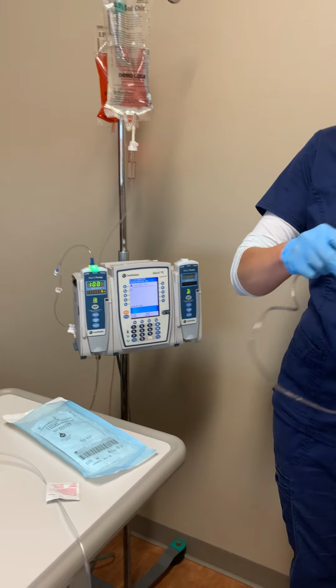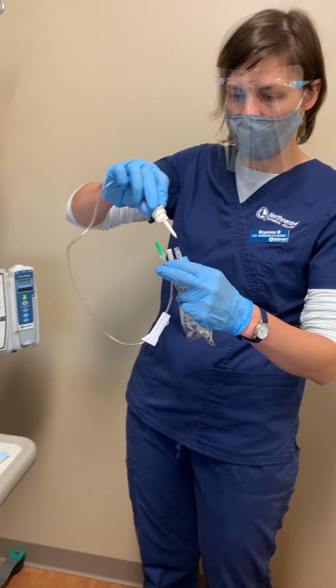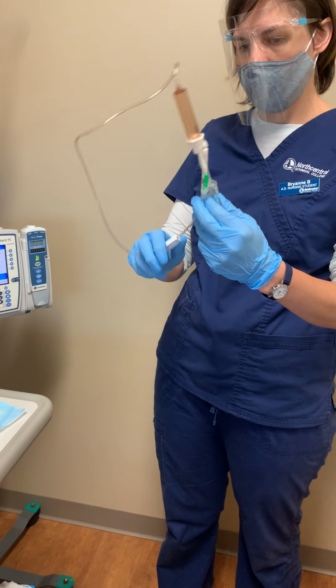Alright. So I'm making sure that this is remaining sterile. I would pop the cap off of this as well if it was still on there. Spike my bag. My roller clamp is closed.